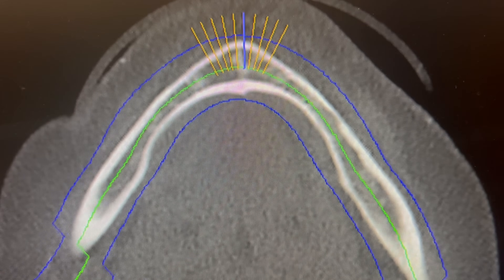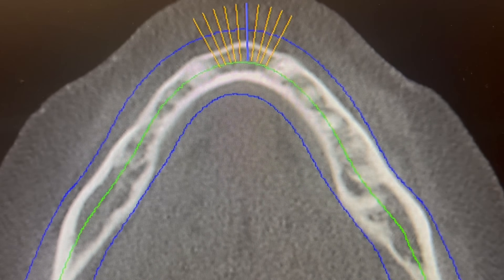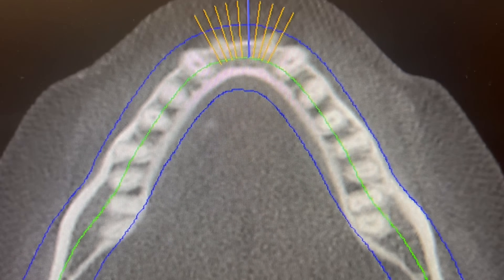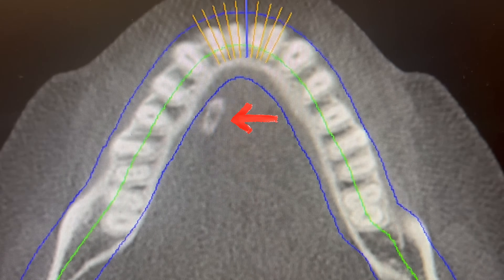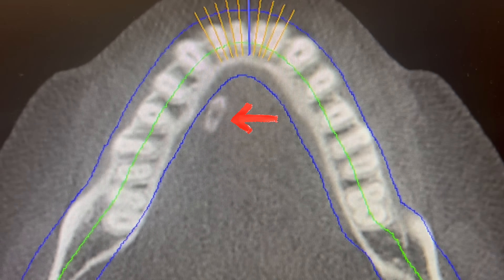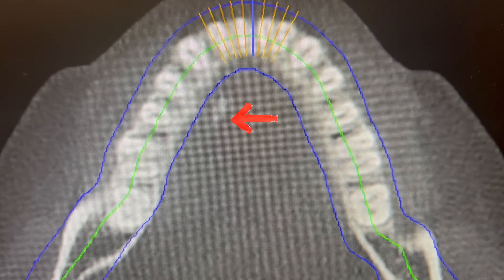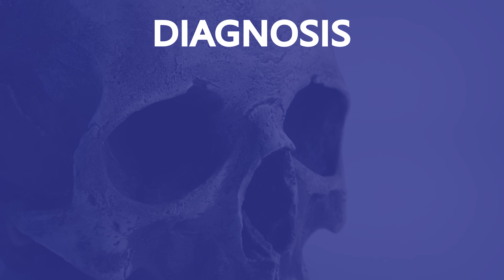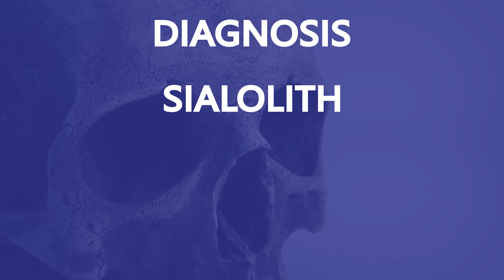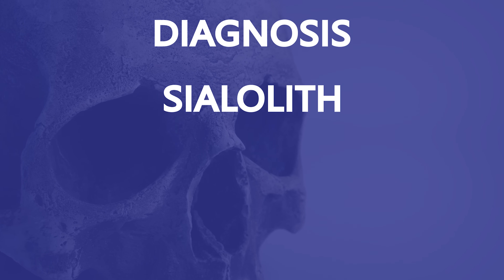I take a cone beam CT, and here's what I see. There is a radiopaque mass in the right floor of the mouth, medial to the mandible. It is well defined and measures about 8 mm in length. This workup points to the diagnosis of a salivary stone, or a sialolith.